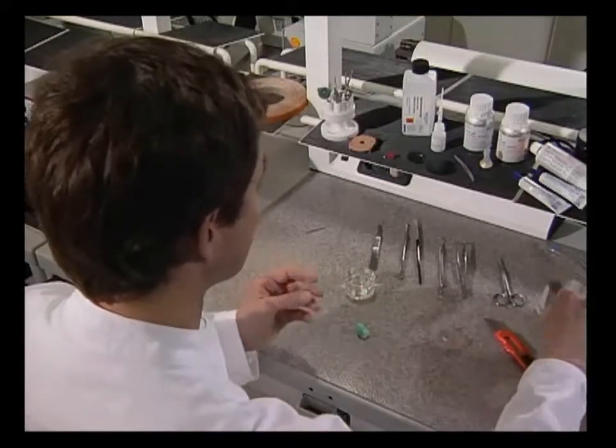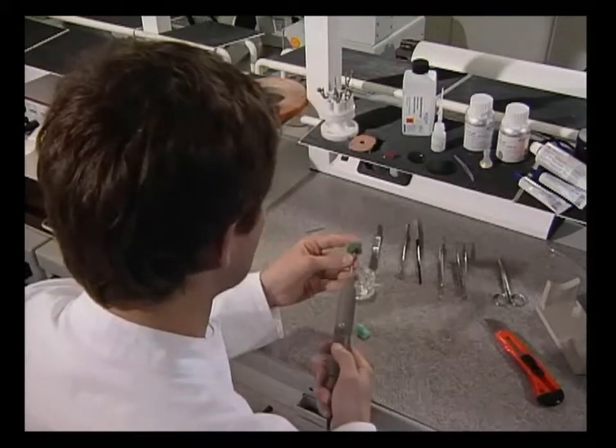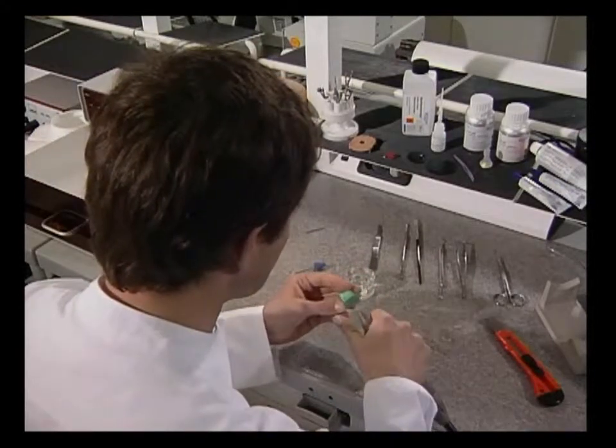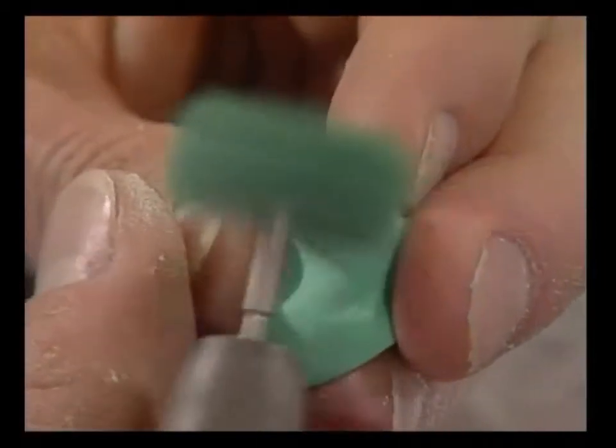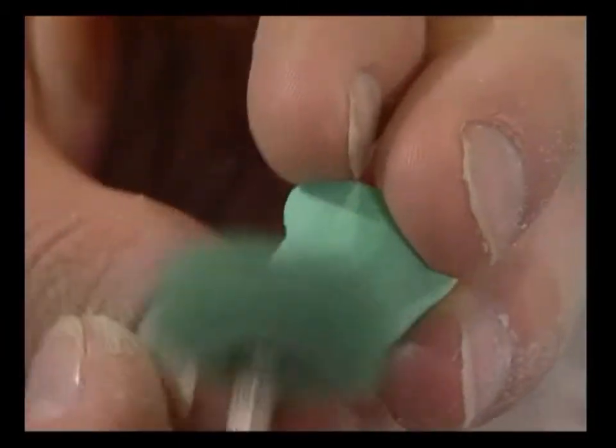The surface of the impression is then reworked with a soft green polishing disc. This is carried out without pressure at a maximum speed of 10,000 RPMs. The surface must not be overly smoothed as this would make the impression too small and the finished plastic would no longer be dense.